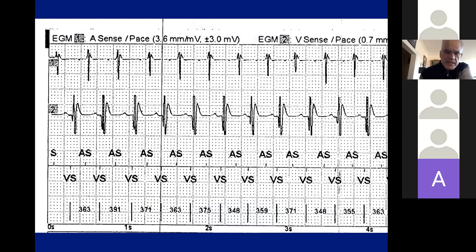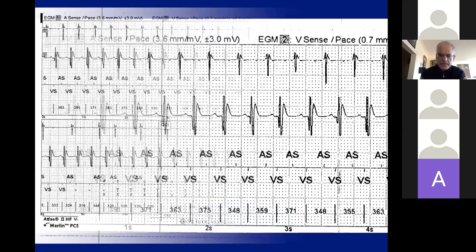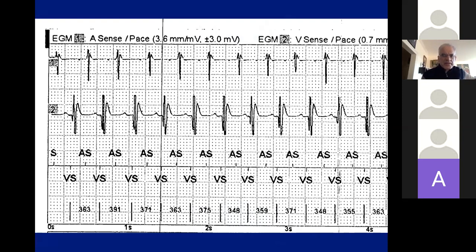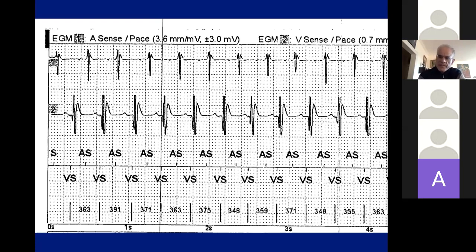Here's an interactive case. This is a dual-chamber device with the atrial channel on top, ventricular bipolar next to it, and markers at the bottom. On first glance it looks like a one-to-one tachycardia. Look at the irregularity — look at what is driving what. Is the atrium driving the ventricle, or is the ventricle driving the atrium?